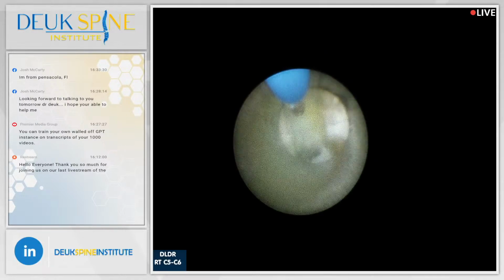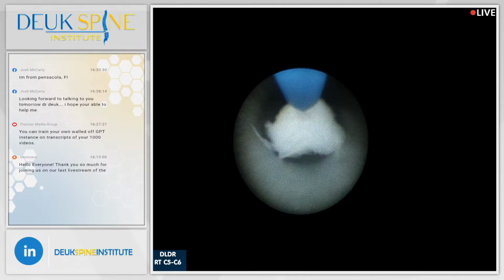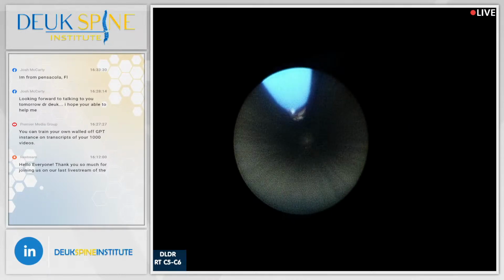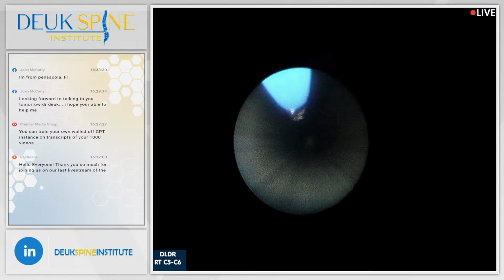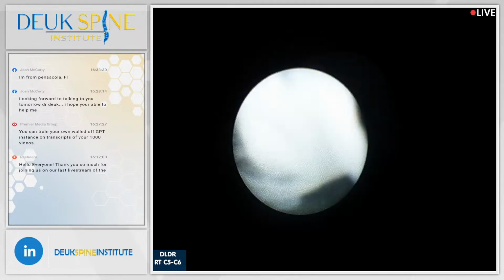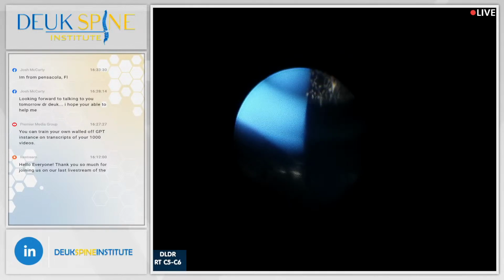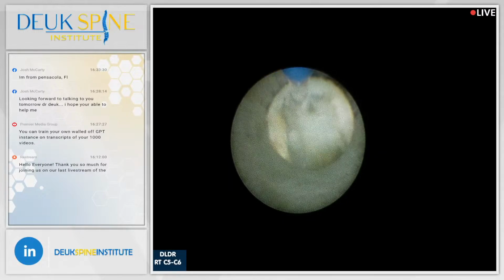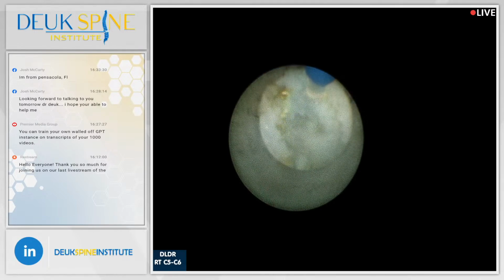Let's go look one more time. There's a little piece there. A couple more little pieces here. These are pieces of herniation. They were hiding right behind the tube. I want to try to get as much of these as I can. They're the ones that cause the inflammation. Oh, he's been hiding a few from us. Look at them all come out. How many is that? Each of those are about 5 millimeters in their widest dimension.